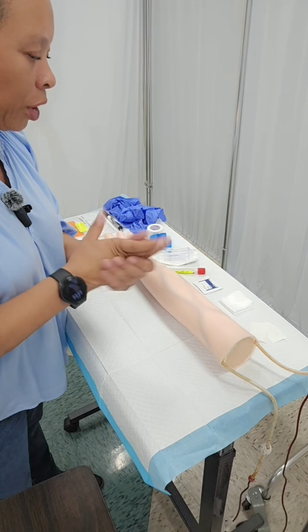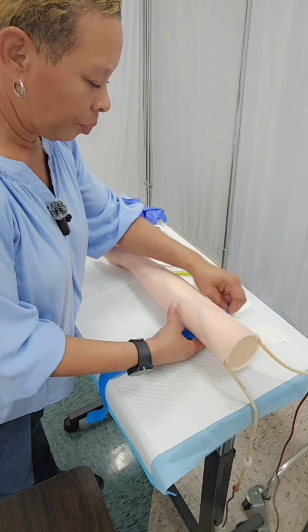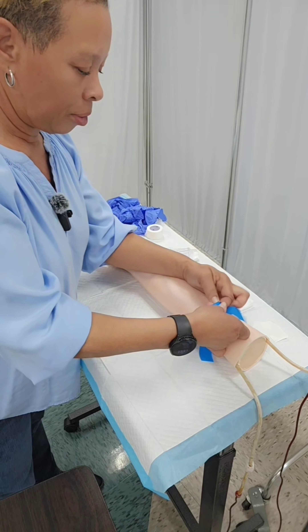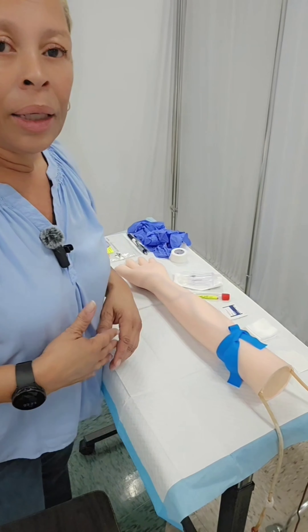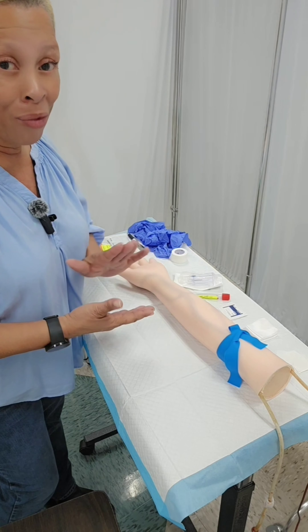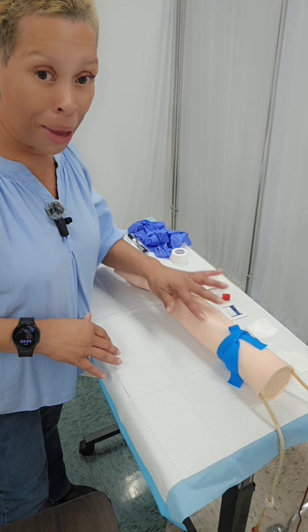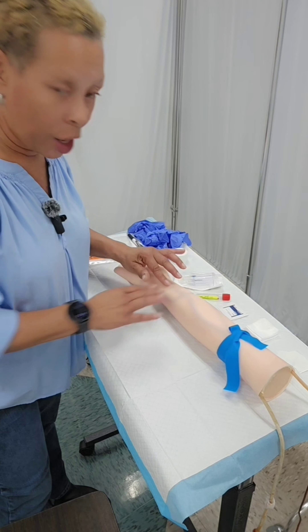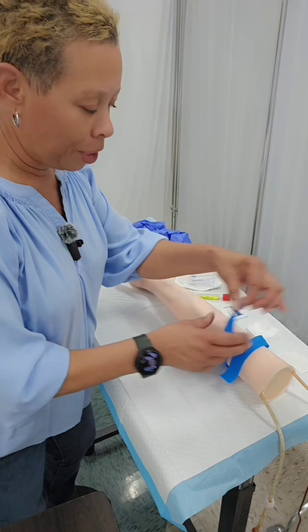The next thing I'm going to do is place the tourniquet on my resident's arm. When you place the tourniquet, you want to make sure that you do not leave it on the person's arm for longer than one minute. Now that I have the tourniquet on, I'm just going to palpate for a vein and see where I want to stick the patient. Once I find the vein, I'm going to go ahead and loosen up the tourniquet.